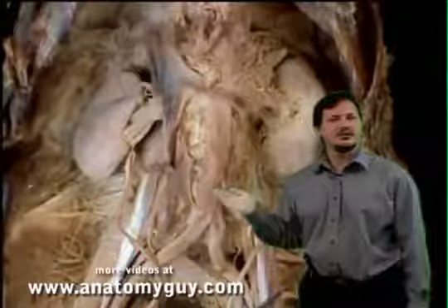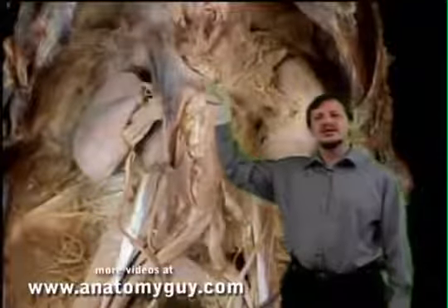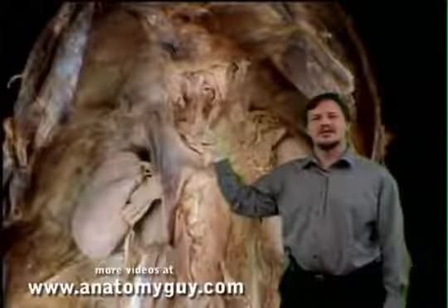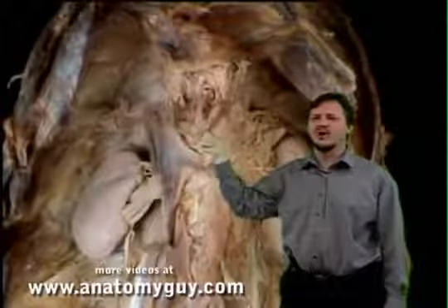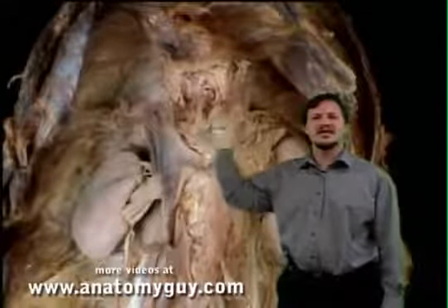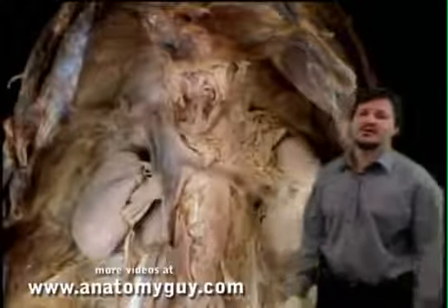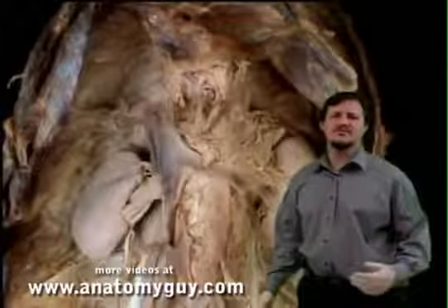As we move back up to some important levels for imaging, you'll know that the inferior mesenteric is around L3. Then there's a little bit of a gap because we have the beginning of L2 where we'd have the superior mesenteric, and then T12 or the beginning of L1 for the celiac, and then the abdominal aorta coming through behind the diaphragm at around T12. There'll be some variation from individual to individual.